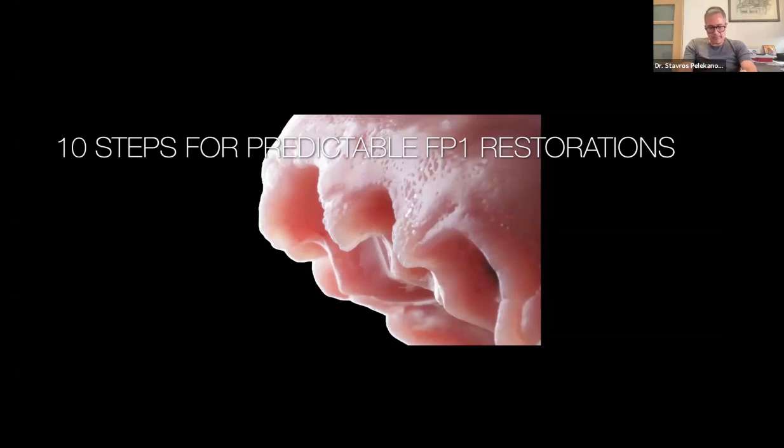This can be the prosthodontist, the periodontist, the guy who is placing the implant, the designer who is doing the guides. In our case, we have another designer for the final design, and another designer for the 3D printed guided surgery.